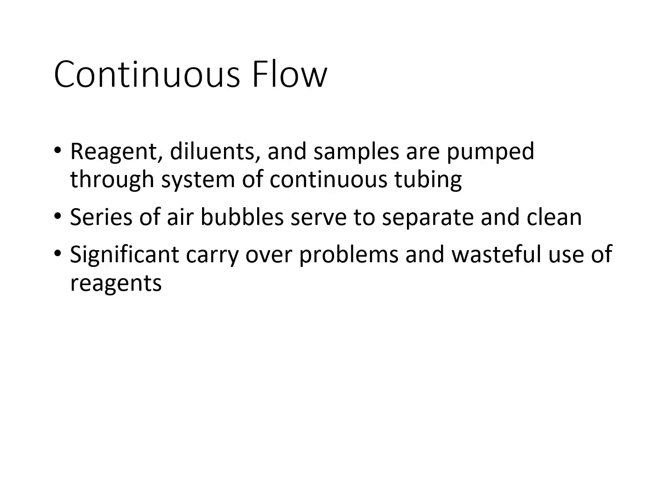So what is continuous flow analysis? Continuous flow analysis is one of the earliest automation techniques that was used in clinical laboratories for chemical analysis. How it works is there is a pumping mechanism. So the reagents, diluents, and patient samples are continuously pumped through a system of interconnected tubing, and there is an air bubble separation in between them.